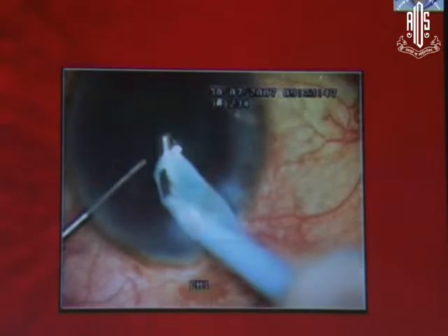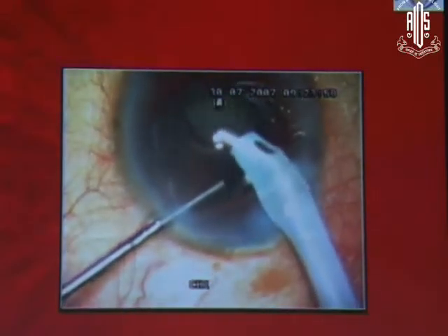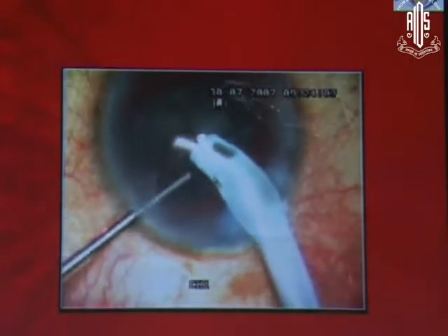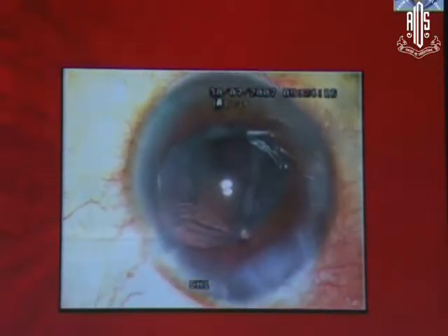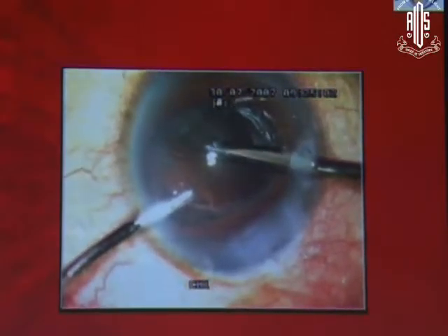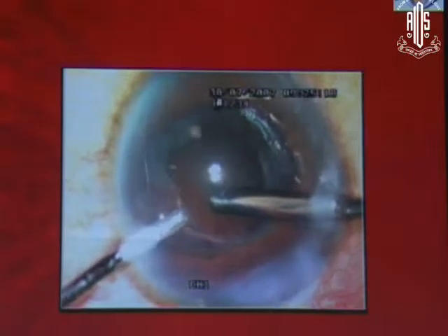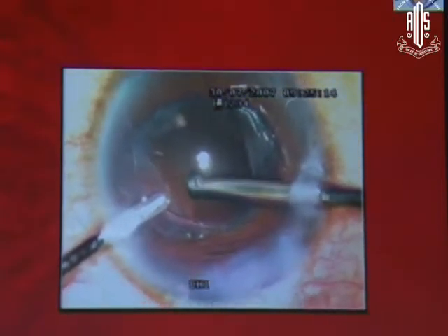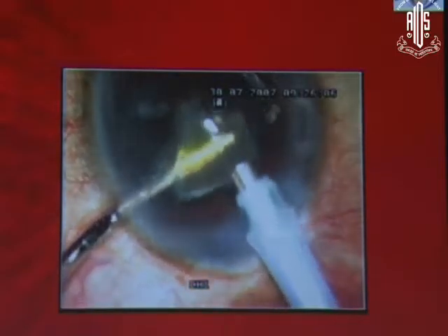Now, the management of a PCR. This video was taken in 2007 when one of my phaco trainees was doing a phaco case. He didn't notice this was a PCR because he caught the posterior end of the capsule missing and the nucleus was sinking. What is more important is when you have a PCR, you might become jittery — you might be operating on a VIP patient — but what you should not do is come out of the eye like that. When you come out of the eye, the tear becomes a huge tear. I went in and did a bimanual anterior vitrectomy, the nucleus started coming up, I got the nucleus out, supported it with the second instrument, phaco'd that, and then removed the vitreous.